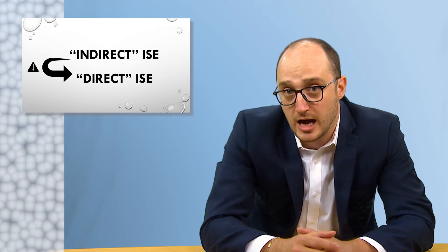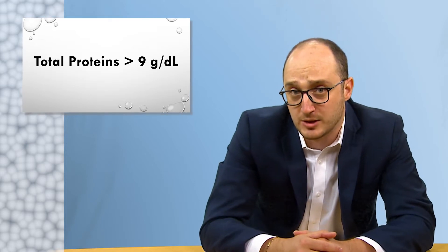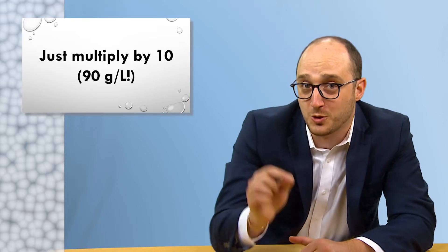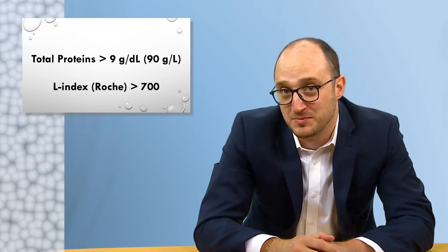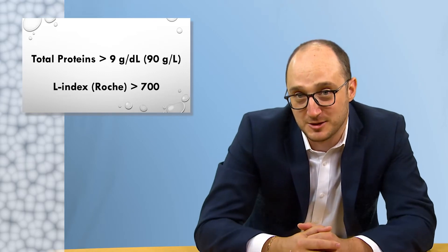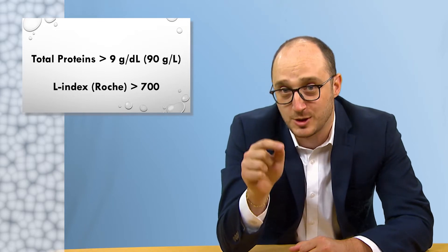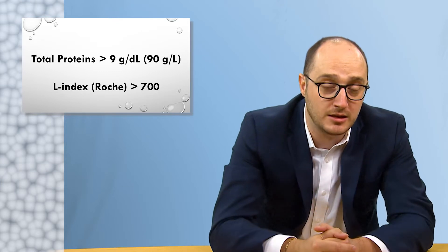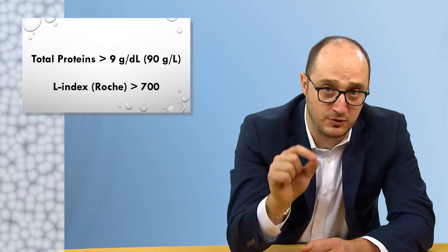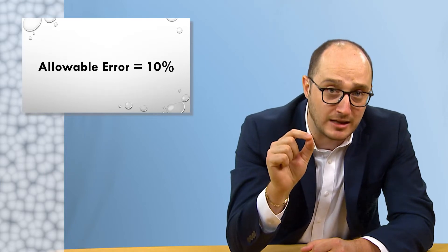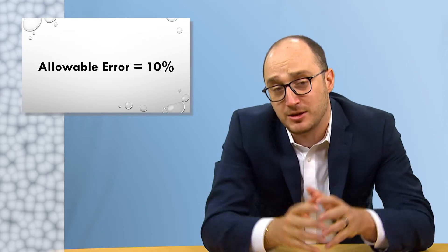For instance, I would build a rule that holds all indirect sodium results with total proteins greater than 9 grams per deciliter — which is equal to something in SI units — or those with a lipemia index greater than 700. This last one applies to Roche users only. And if both of these numbers sound too low to you, it's because the thresholds in current product inserts and some publications are misleading. Please pay attention when referring to product inserts and published literature on this subject. Most manufacturers set an allowable error of 10% for their interference studies, which is highly inappropriate for plasma sodium.